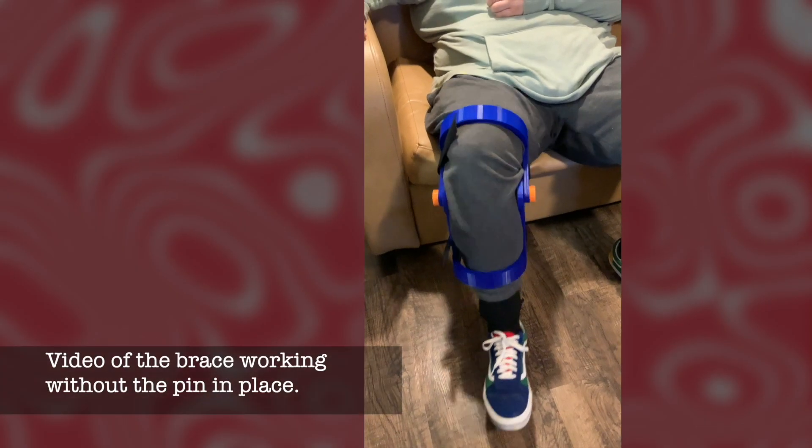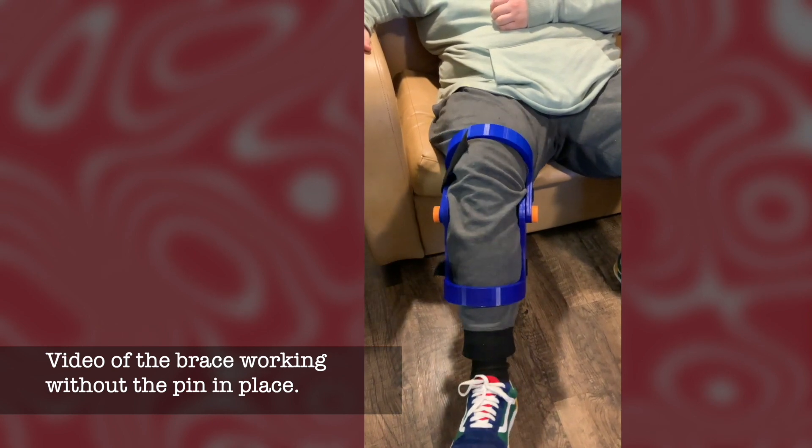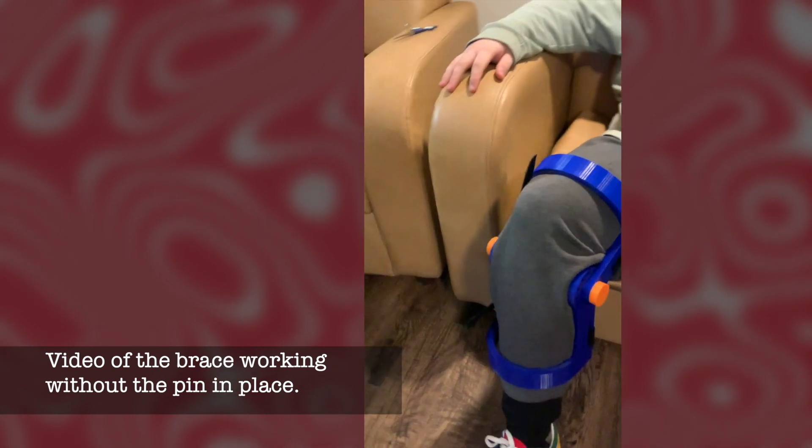In this video, no pins are set on the brace, allowing the patient to move the knee freely. It's just there for normal support.